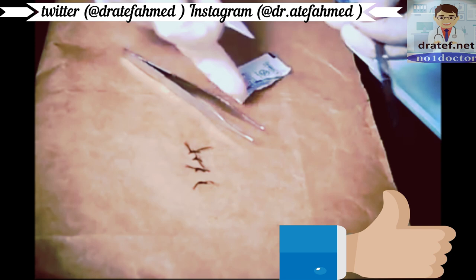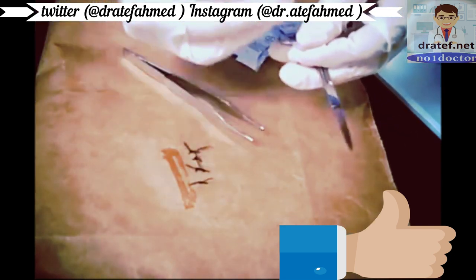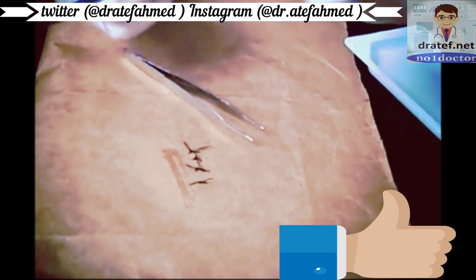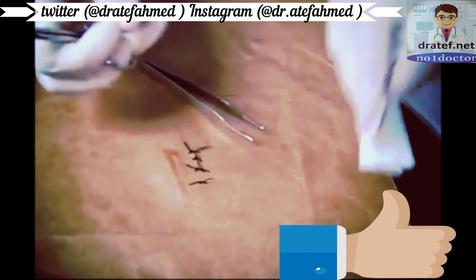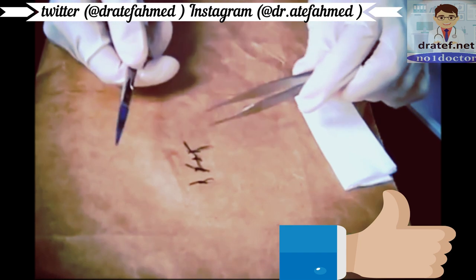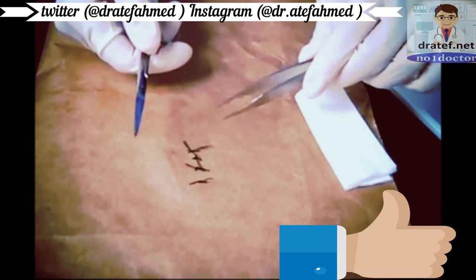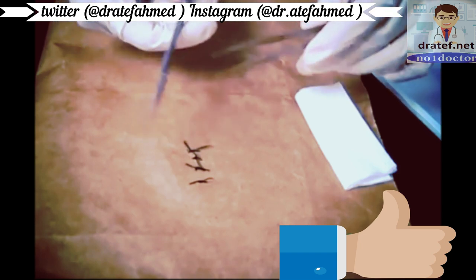You can rub the alcohol on there to make sure it's nice and clean. Just in case there is a little bleeding, it does come with a piece of gauze. First, you're going to count your sutures — we have four. And if you want, you can also count at the end.